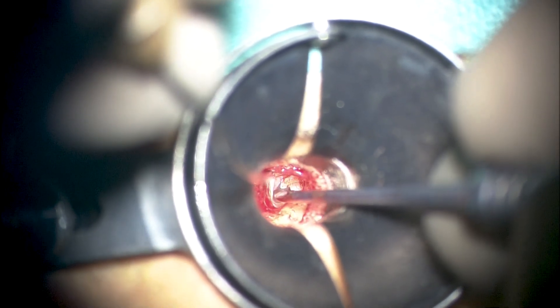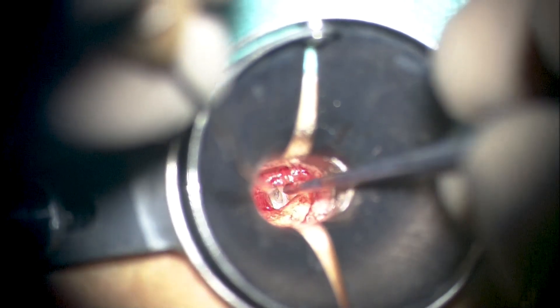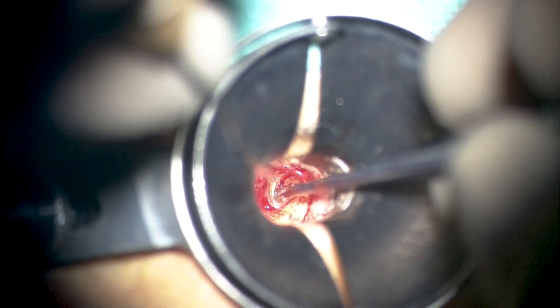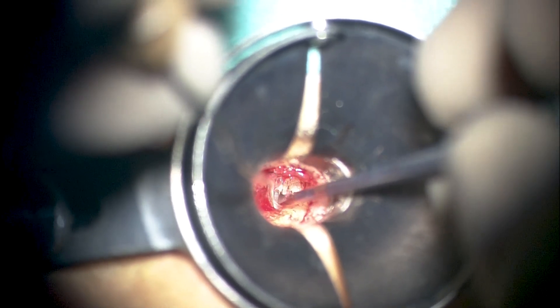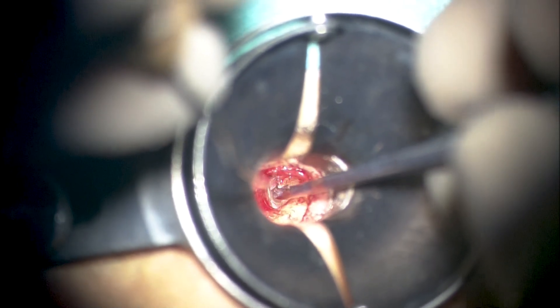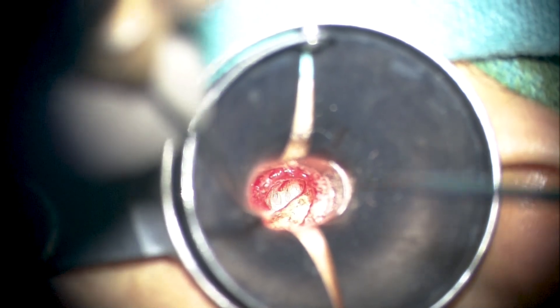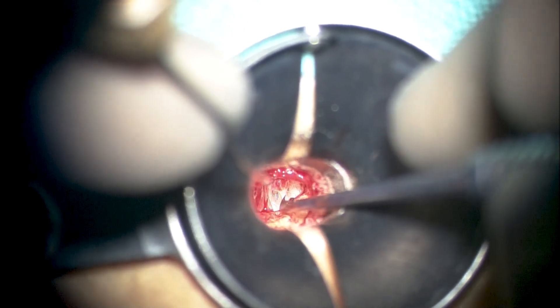Here we are using a slightly curved sickle knife to gradually elevate this pocket over the long process of the incus. Because this pocket is attached to the long process of the incus, it is very important to be extremely patient in this step. Even the slightest amount of traction on the long process of the incus could lead to dislocation or disarticulation of the incudostapedial joint, which would be catastrophic in our attempt to make this surgery as least morbid as possible and to retain the natural hearing of this pediatric patient.